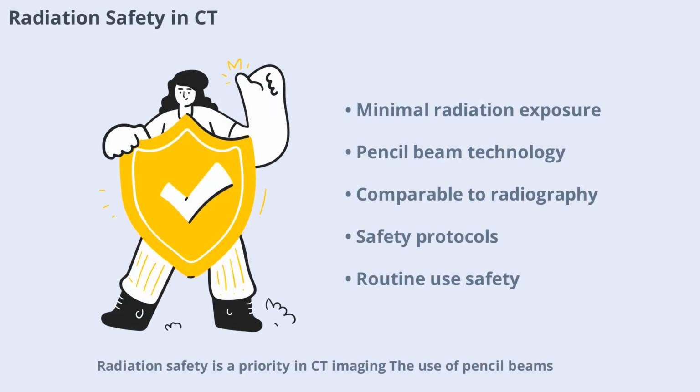Radiation safety is a priority in CT imaging. The use of pencil beams and advanced technology ensures minimal exposure, comparable to conventional radiography. Proper protocols and equipment maintenance further reduce risks, making CT scans safe for routine use.